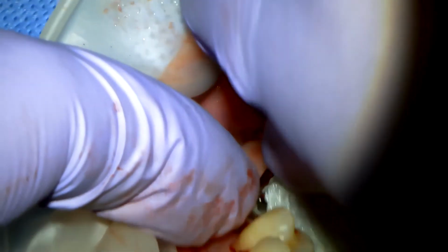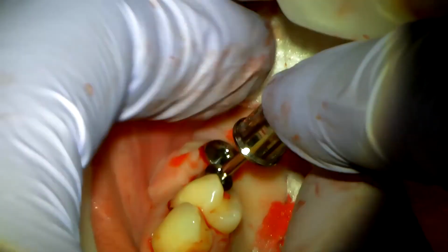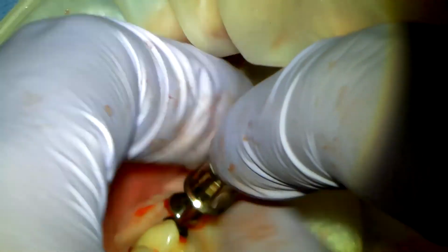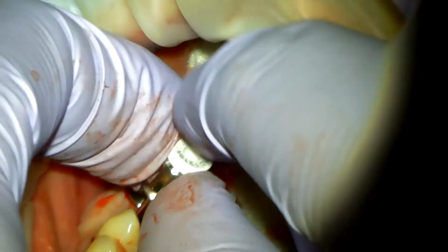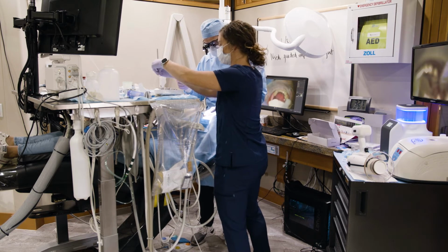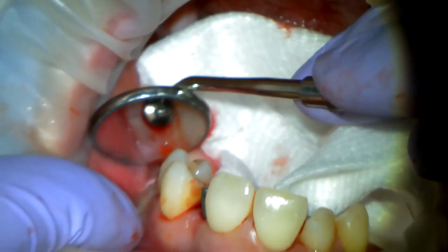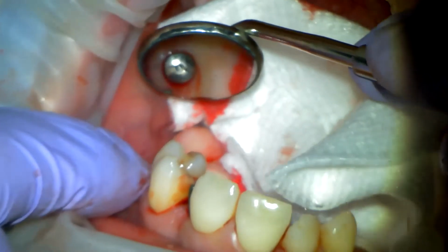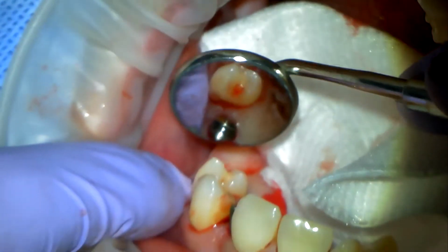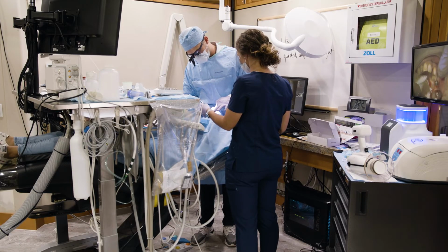Just about down. There it goes. Hand tight. Number 14 looks beautiful. Here's number 13. Let's get a mirror and let's show these off. So there they are. There's number 14. There's number 13. Good keratinized tissue, good primary stability, beautiful position. That is a predictable workflow with a sinus lift, mind you. Hope you guys enjoyed. Have a good one.